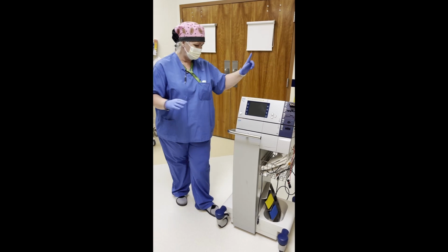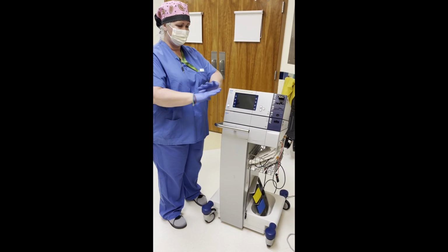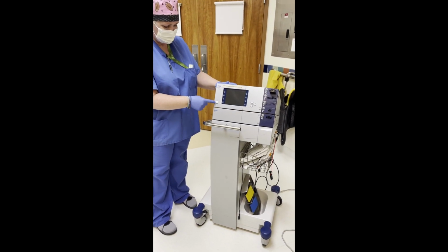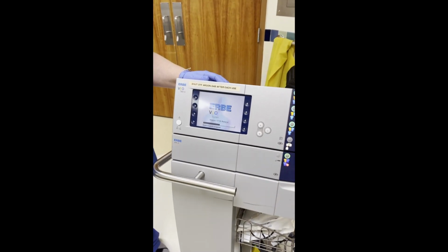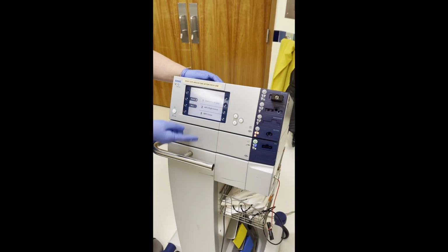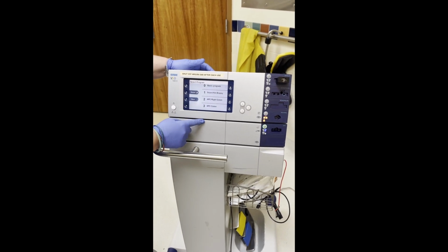You're going to plug it in. It's already plugged in. To turn on the ERBE, this is going to seem kind of basic, but in the heat of the moment, it's not really basic. I'm going to turn this on right here. It's going to sing a nice little song. And then you're going to see a little library, if you want to call it that, a list of things you can do.